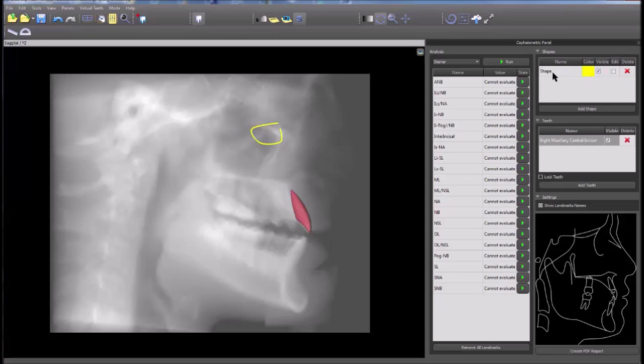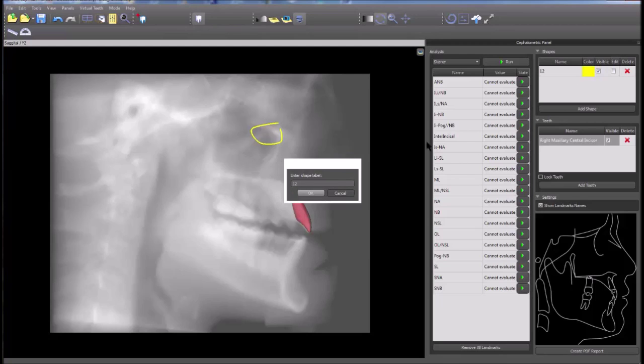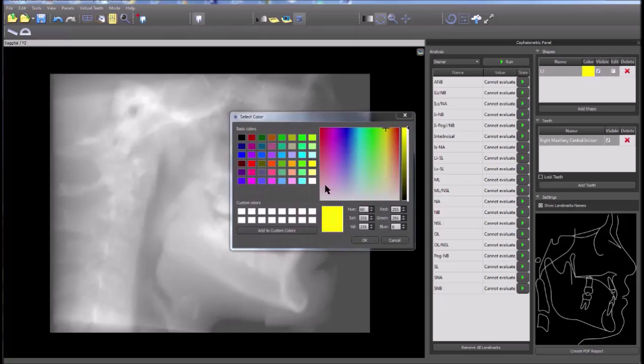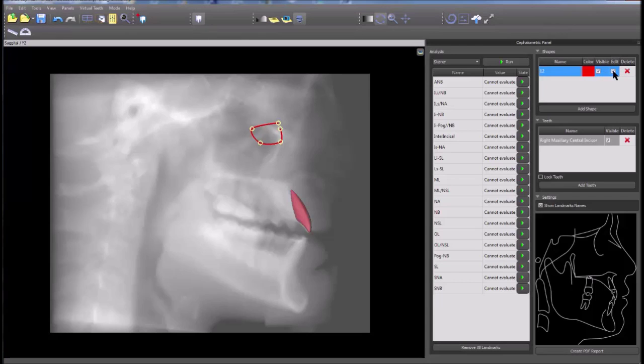The shape name and color can be modified. The shape visibility can be toggled on or off, and the edit control can also be toggled. Click on the red x to delete.